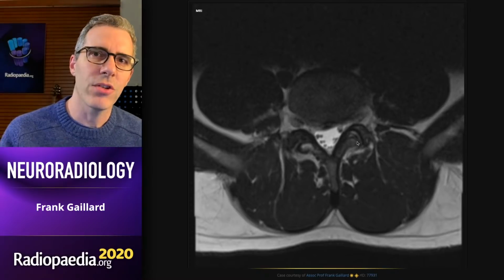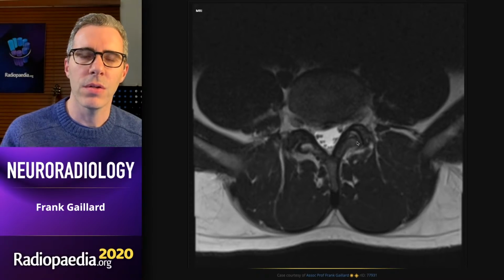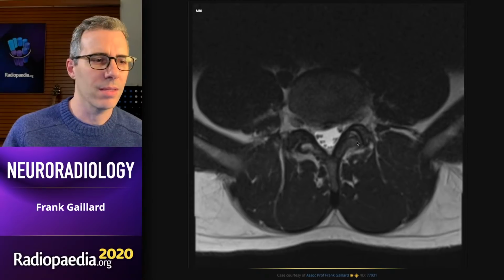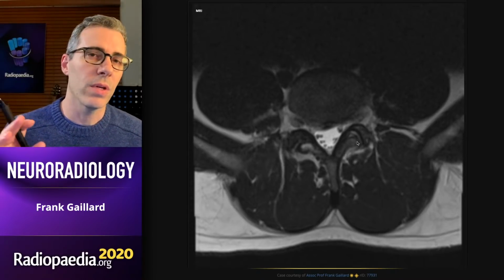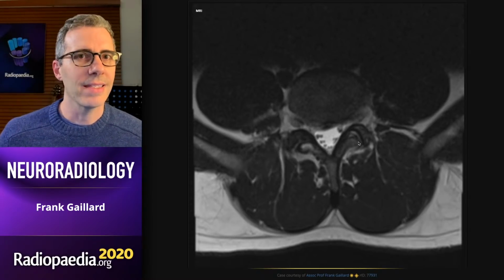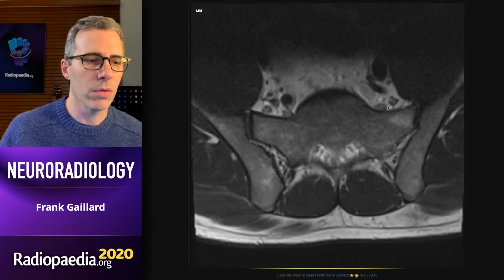The last one, which I think is actually more useful than pretty much all the ones that we've talked about at this particular level, because it gets to the heart of the matter, which is you're not so much interested in which nerve you're going to call, you're interested in which functional nerve is affected, especially in a patient who has multi-level degenerative change and you're trying to identify which the symptomatic nerve is. And that is looking at the size discrepancy between the L4, L5 and S1 nerves as they lie on the sacral ala. So if we come down and there, that's probably the best look.